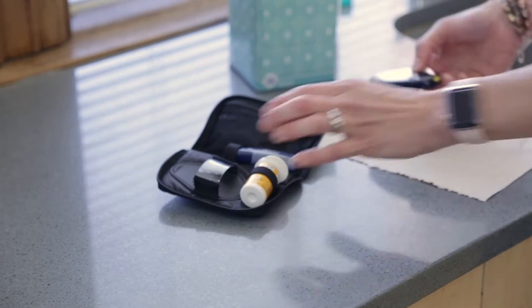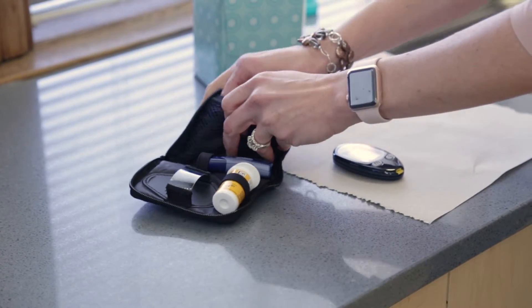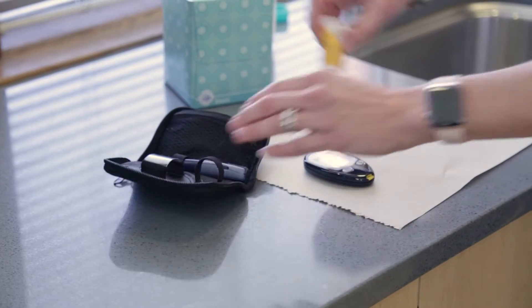If you want to test your blood sugar, first gather your equipment. Your equipment may look different than what we show here, but it works the same. Your equipment includes a glucometer, which is a blood sugar meter, lancets, test strips, lancet device, and a tissue.